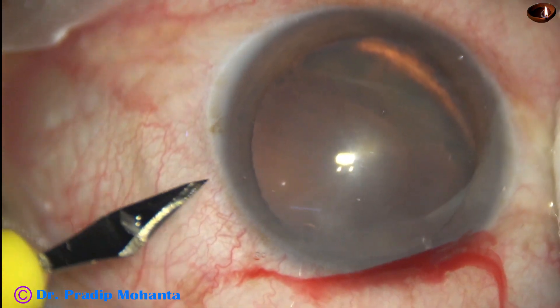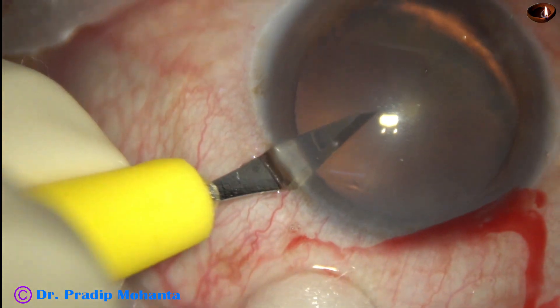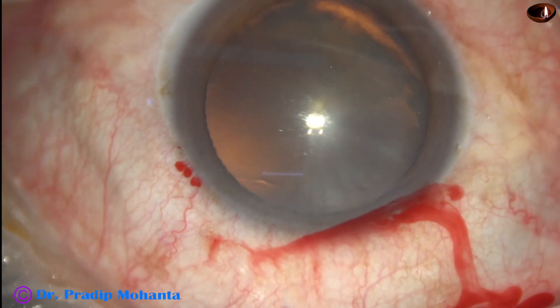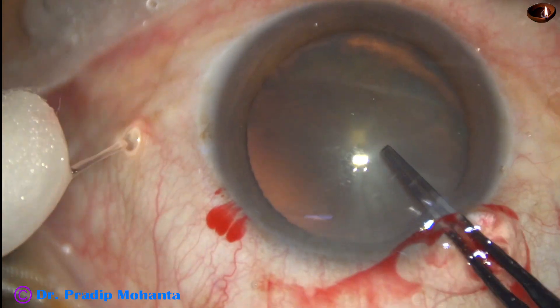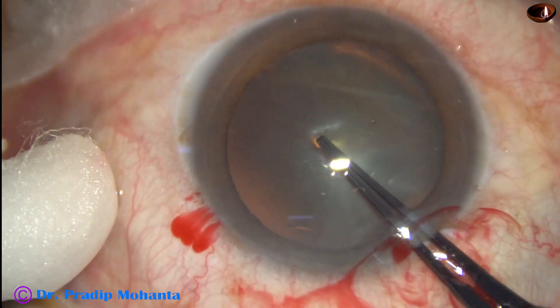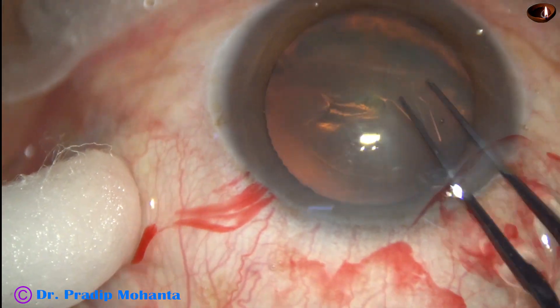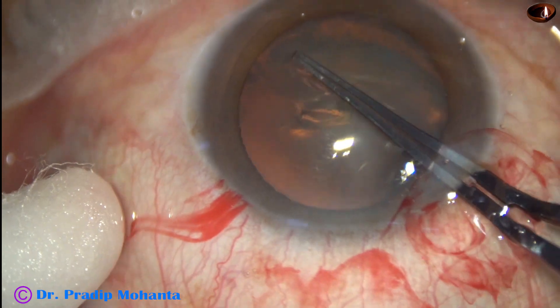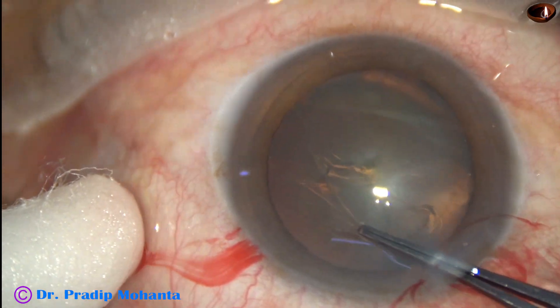This is the side port at about 3 o'clock, away from the main incision. Now capsulorhexis is done with Utrata forceps. The size of this rhexis is about 5.25 millimeters.